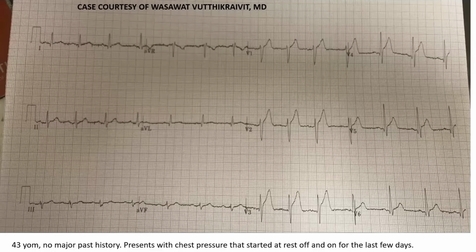I want to show another case. This case was shared by my prior great fellow, Wasawat. This is a 43-year-old man with no past medical history. He presents with chest pressure that has been going on at rest, off and on, for the last few days. This is his EKG.